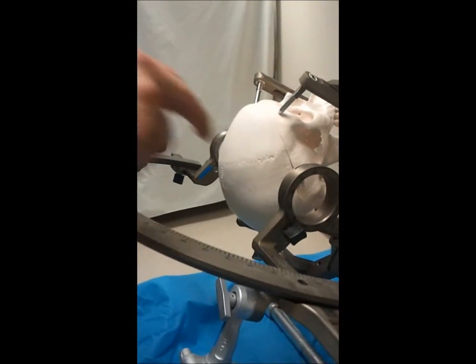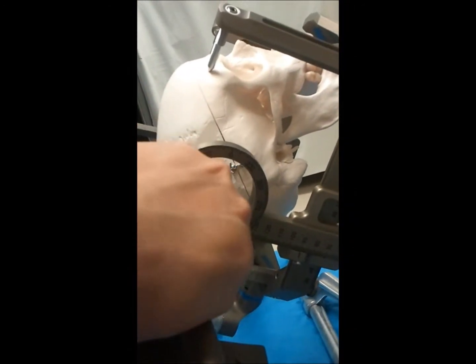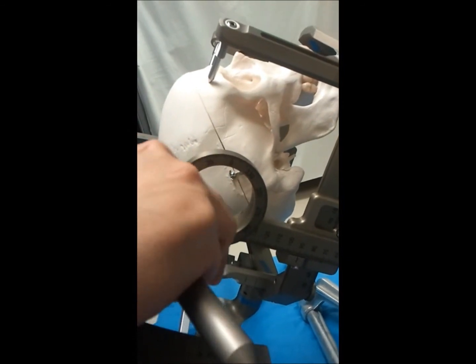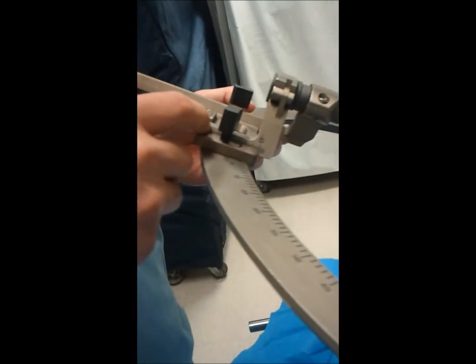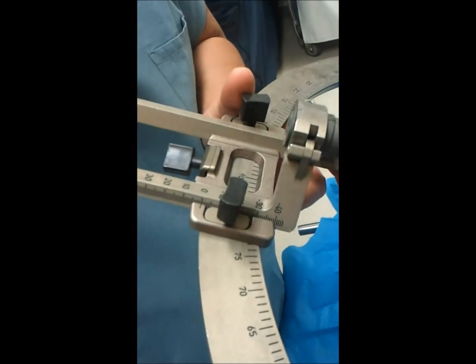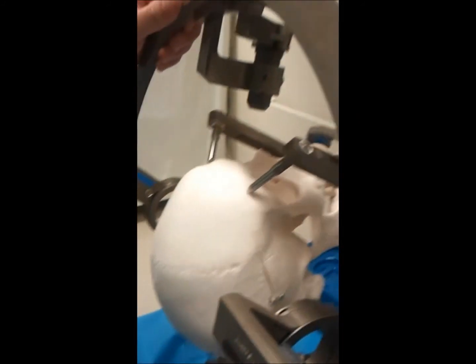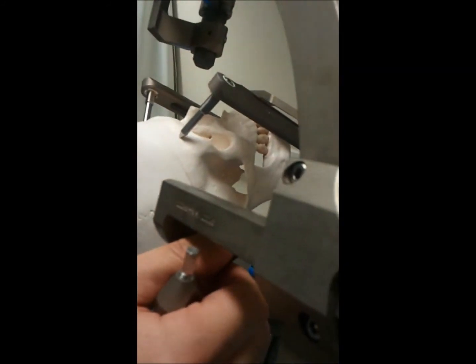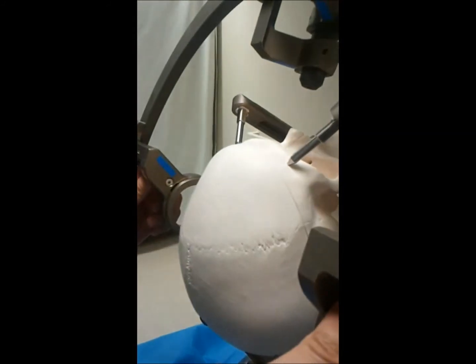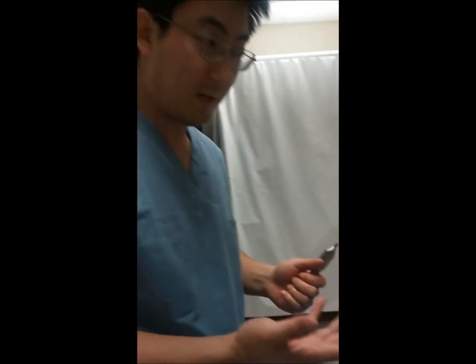And then setting your ring and your arc to the appropriate numbers. Double checking that your offset is 0 here, and then confirming your target location as far as your skin incision if needed. And then if burr holes are to be done, you can swing this out of the way and reset your ring value and get all the work you need to do as far as your craniotomy, and then bring that ring down. Okay, I hope that is helpful.